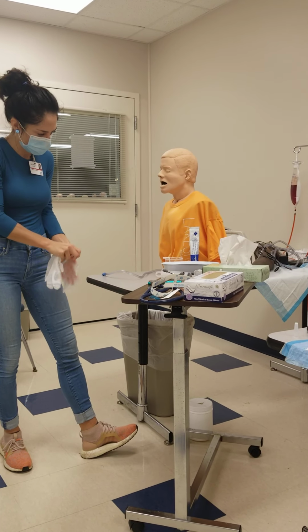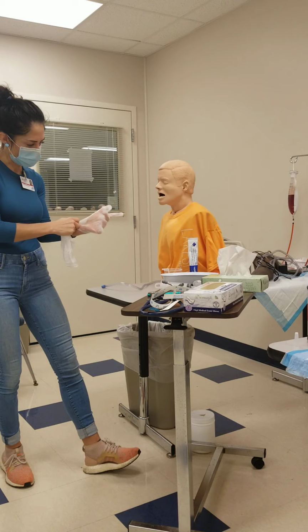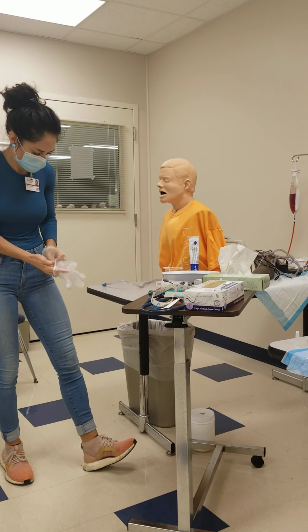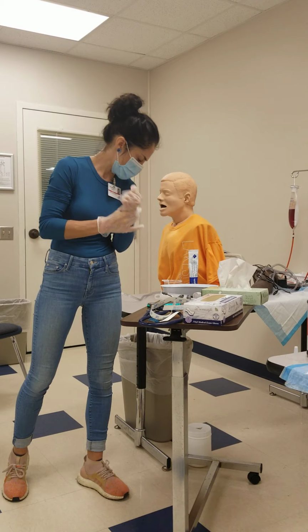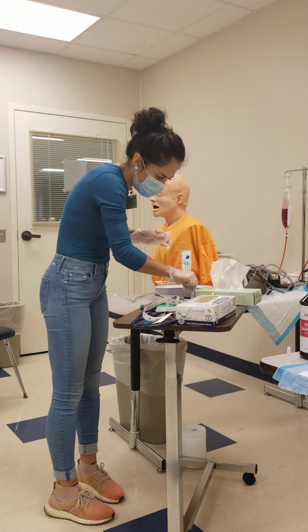So what we'll do, take a little piece of tape here. So I've got a little piece of tape.